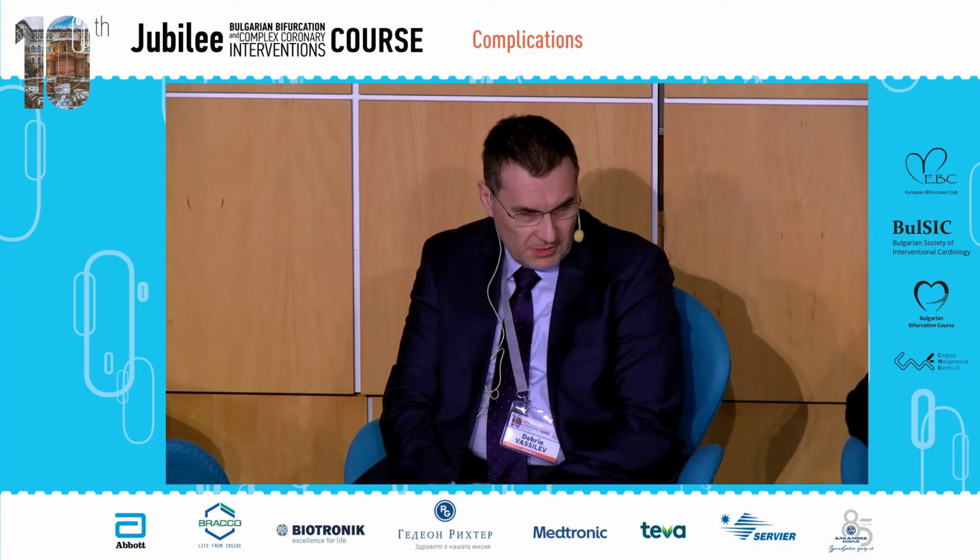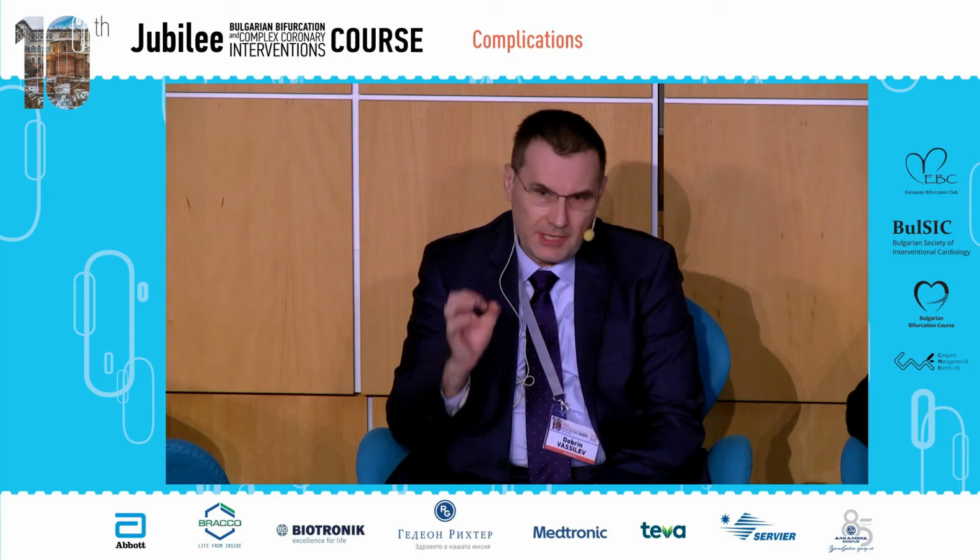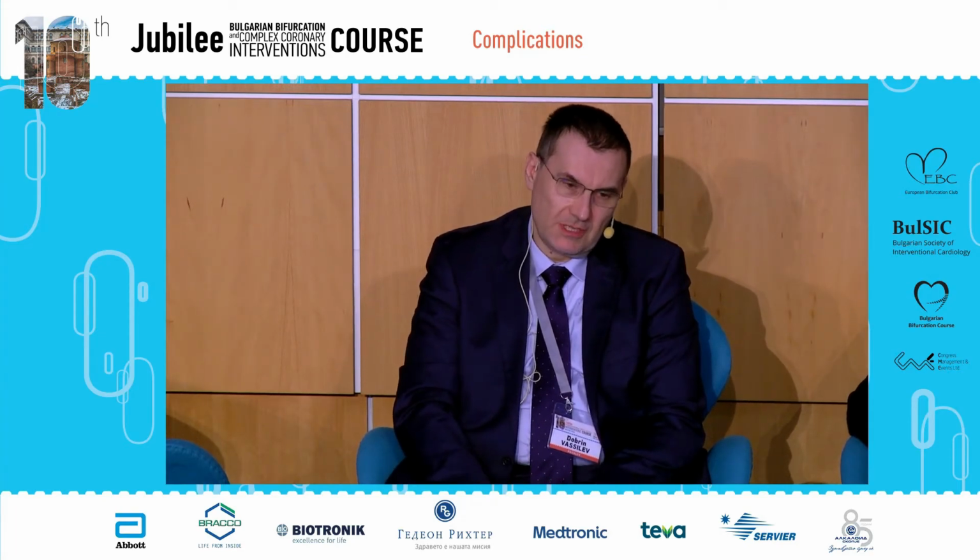Actually, after unsuccessful rotablation, I told him that in that case I would go subintimally just to pass this calcification, because it was a calcium ring which was impossible to dilate. We have several cases with this strategy quite successful.